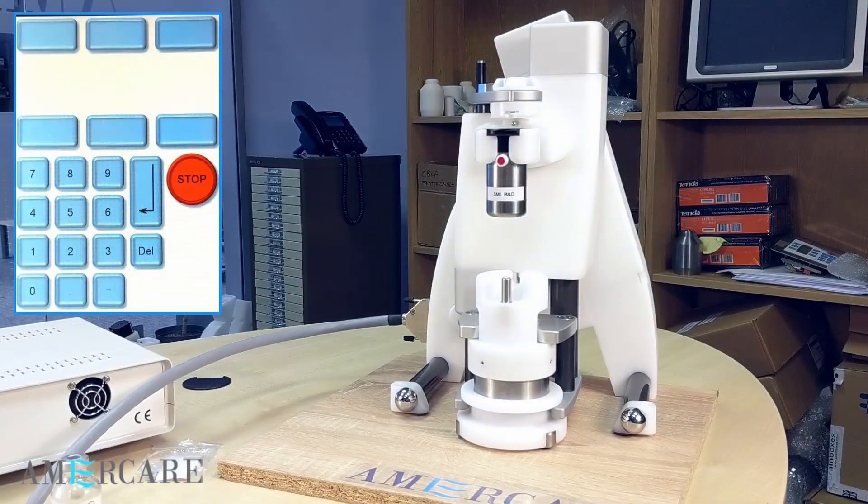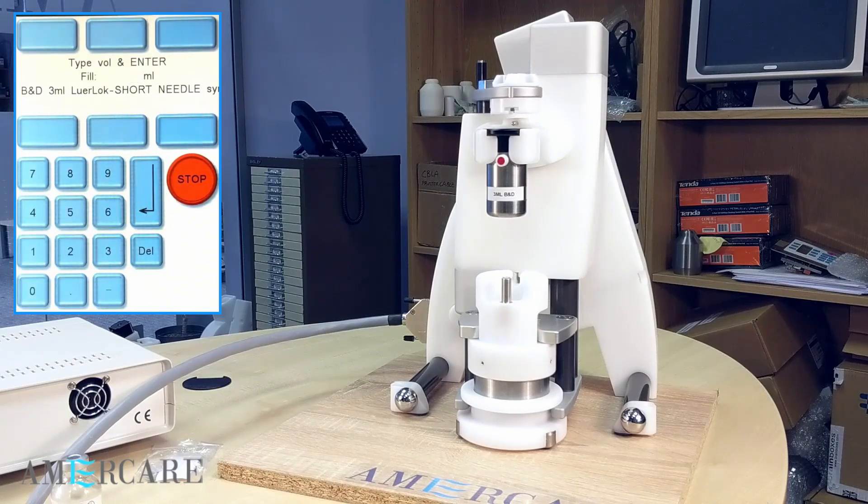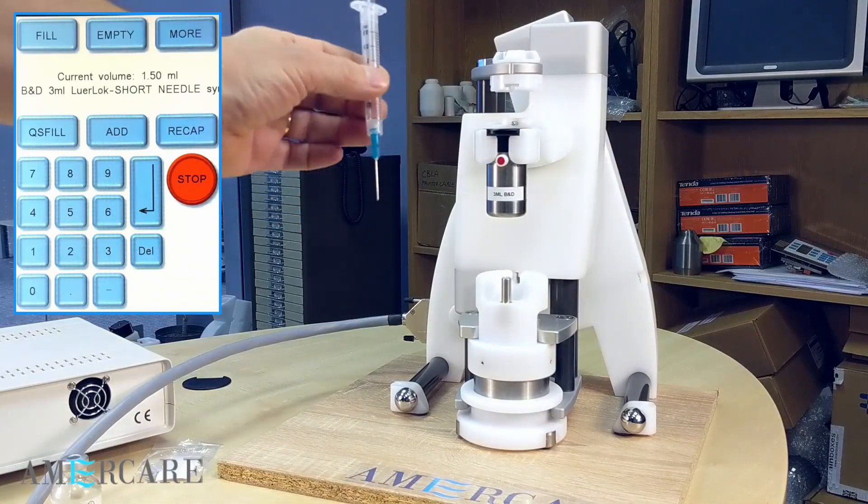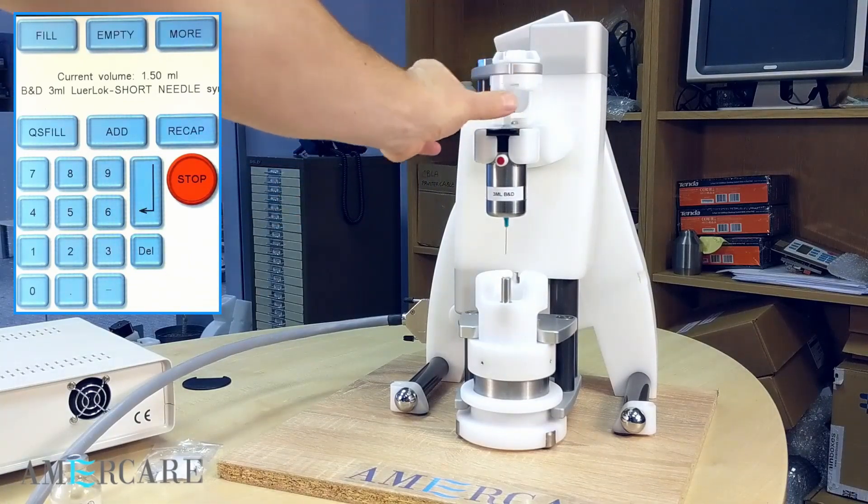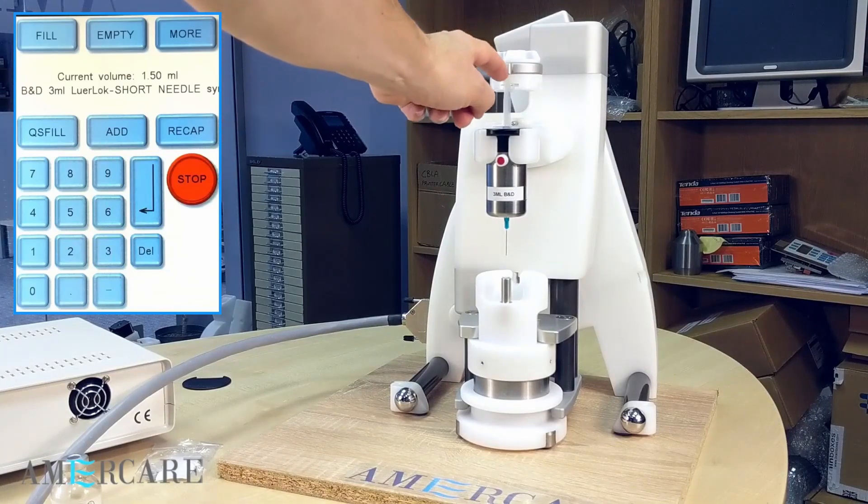Press QS fill. Enter the pre-filled volume, 1.5 milliliters and press enter. The plunger will now move to the correct position to accept the pre-filled syringe. Drop the syringe into the shield. You can now use the add function as before.